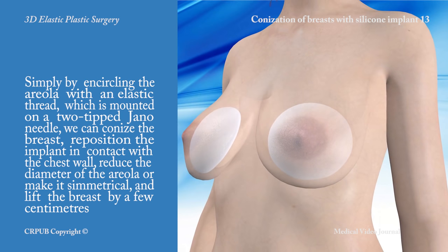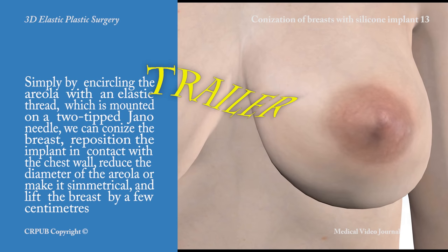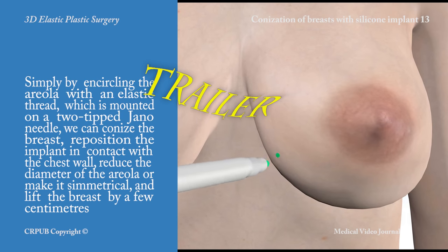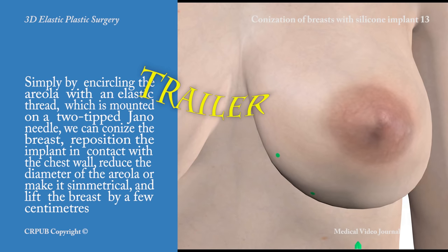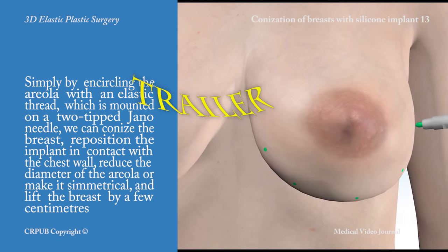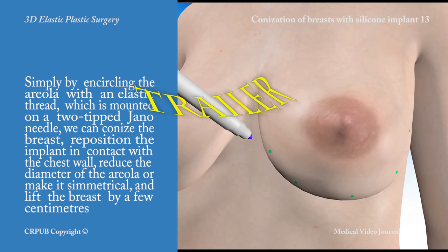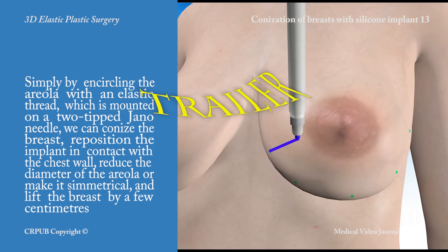Simply by encircling the areola with an elastic thread, which is mounted on a two-tipped jano needle, we can conize the breast, reposition the implant in contact with the chest wall, reduce the diameter of the areola or make it symmetrical, and lift the breast by a few centimeters.